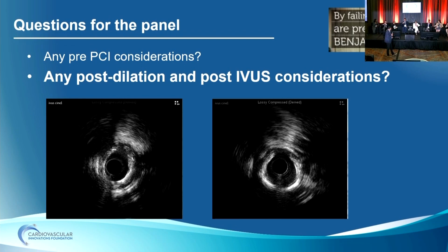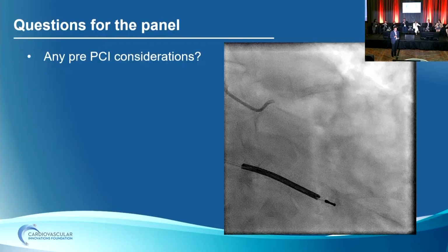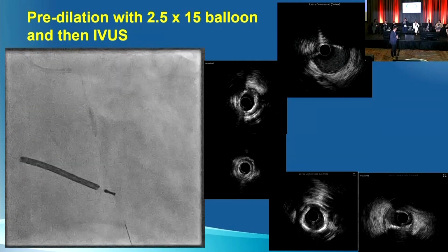Yeah, the balloon expanded very nicely. I don't know what the IVL is going to offer, at least in terms of stent expansion, unless in this view it's expanded, and if you take an orthogonal view, it looks not very well expanded. But in this view, it looks really good.